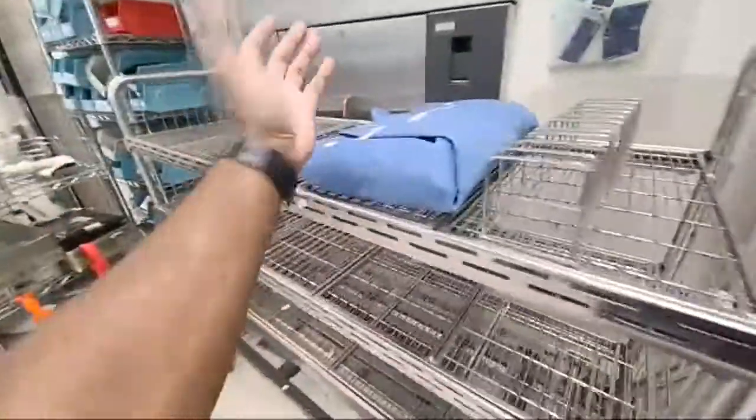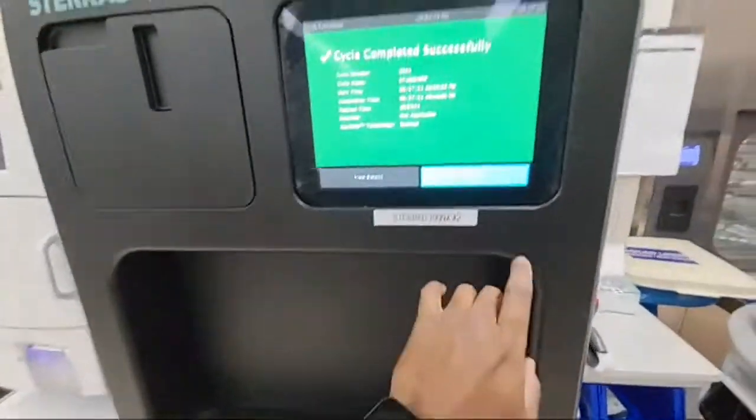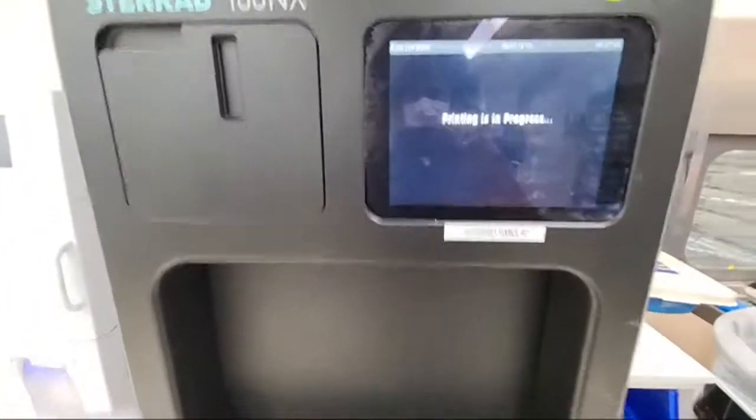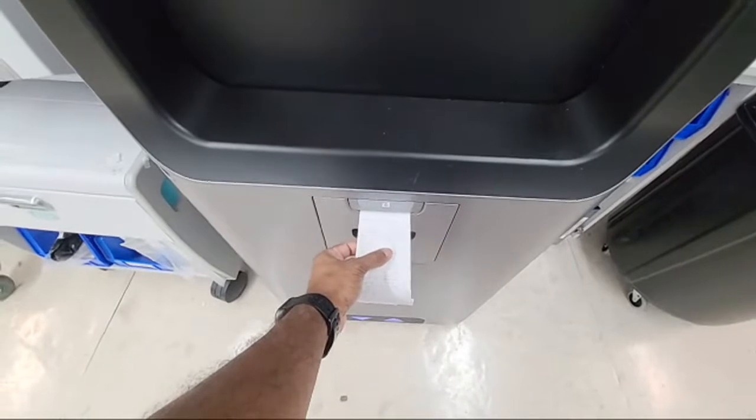They will tend to be drier faster, depending on what's inside the wrap packs. I mean, there could be heavy metal items in there too. Oh, so this one just finished. This is one of our sterile machines, hydrogen peroxide machines. So we get to do that. Popped out a little receipt.